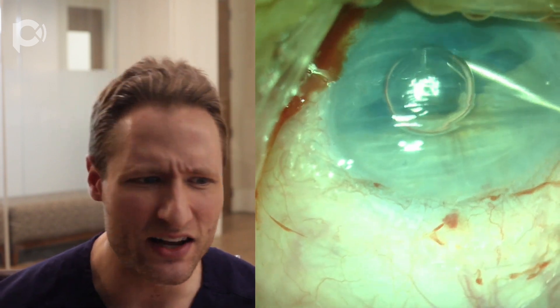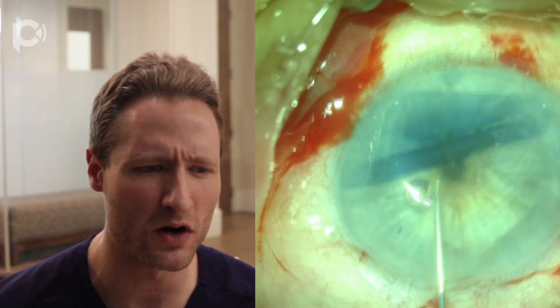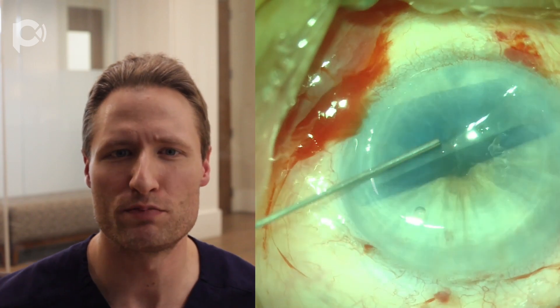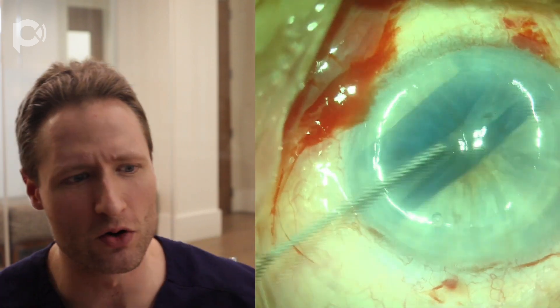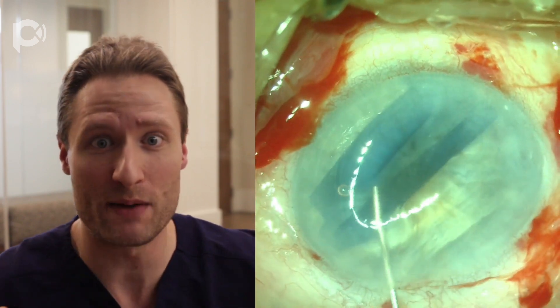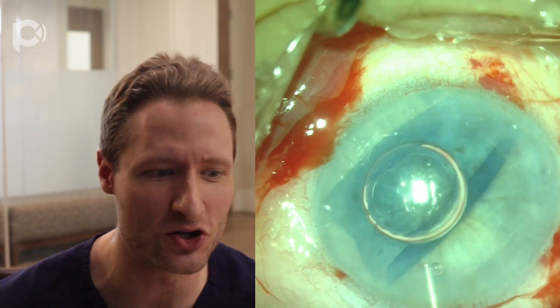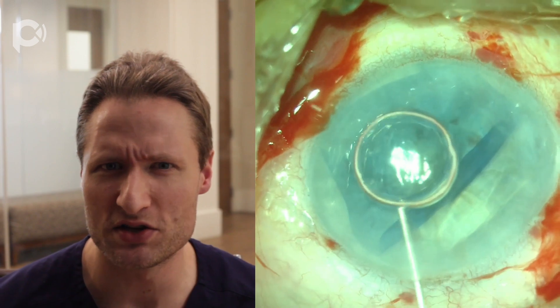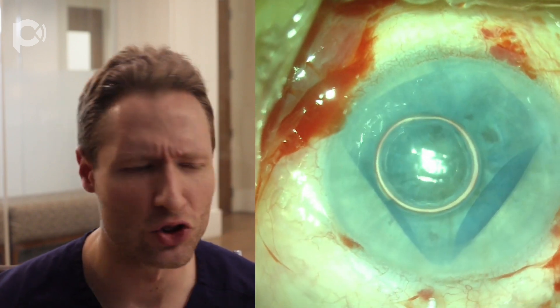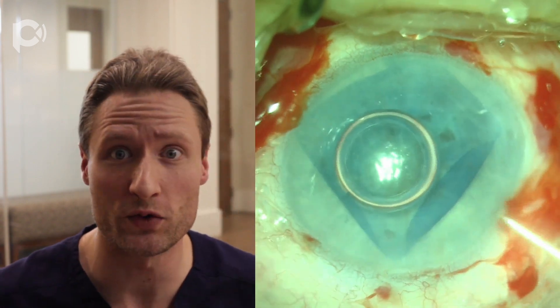I'm going to place a bubble on top of the graft, but you'll notice the bubble is not really interacting with the graft — it's floating away. The reason is the chamber is so deep: the graft is down below the bubble, and the bubble is floating up high. So they're not really interacting. I'm trying to maneuver the graft with a cannula to push it over underneath the bubble — but that's not really a good idea. What you should do is center the graft in the eye first, so that when you put a bubble, which floats up to the apex of the cornea in the center, it automatically engages with the graft.